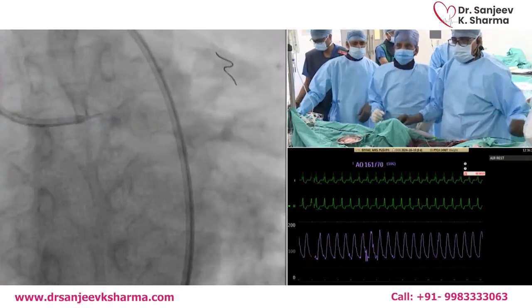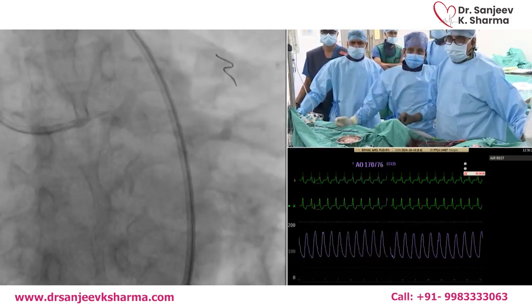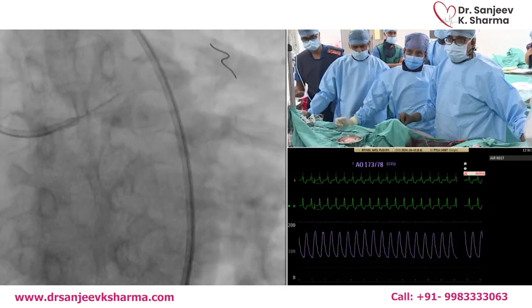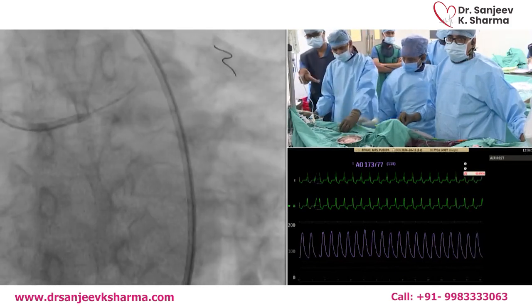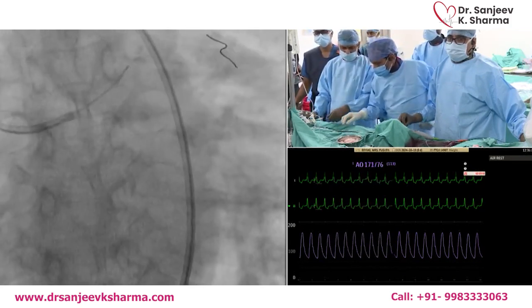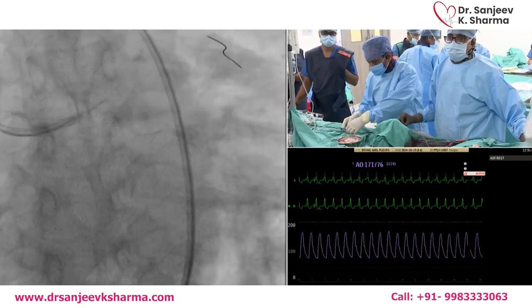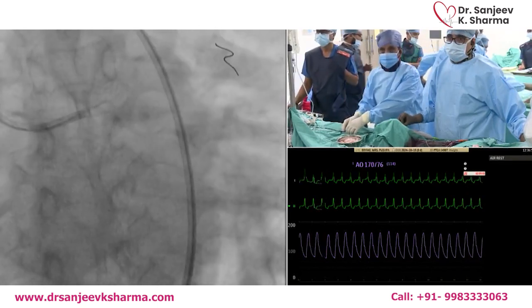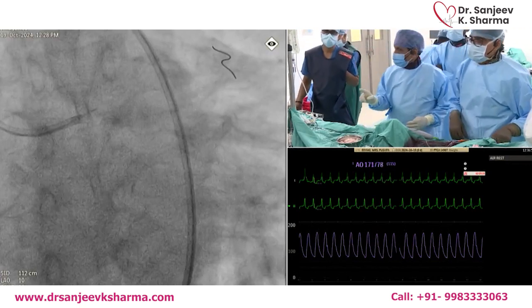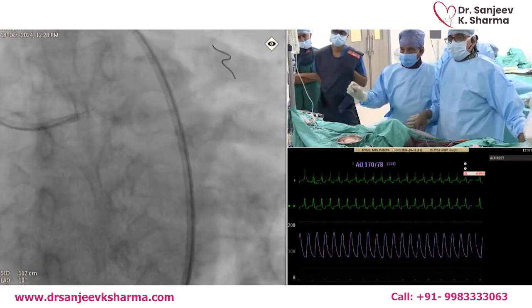One mention I'm going to make: because Dr. Sharma said that they sometimes use the high speed of orbital, in the few cases I've used high speed of orbital, I use it while I'm pulling back. So I feel like I have more control, so it doesn't jump out of the desirable area and cause a dissection or perforation. So on the way back, I may occasionally use the high speed, but not going forward. Very good point. It is bi-directional, going forward and going back. It takes care of both, with 1 millimeter per second advancement as well as pullback.